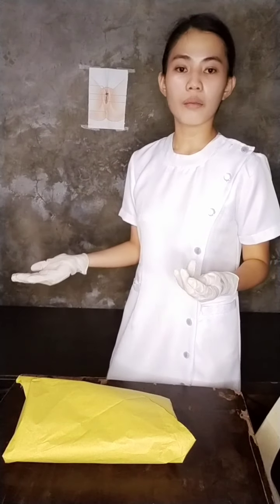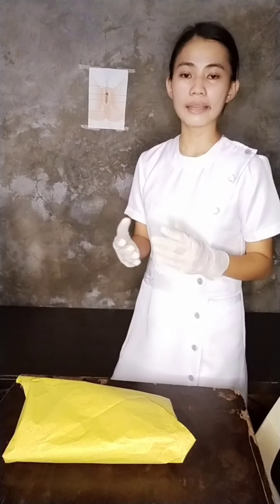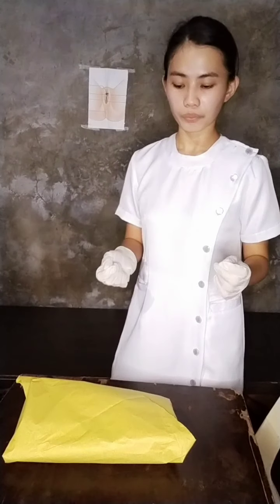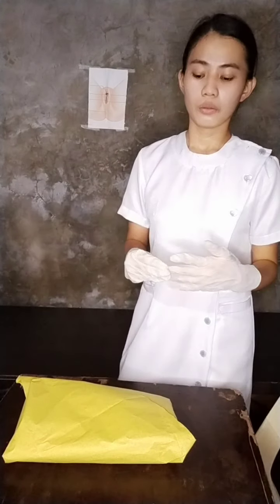adjust the bed to the appropriate height, and then position your patient in a supine position with the two legs separated, or position your patient in dorsal recumbent to get more access for insertion of the catheter. Next, you need to wear gloves. Since I am wearing gloves, we can now proceed to the procedure.